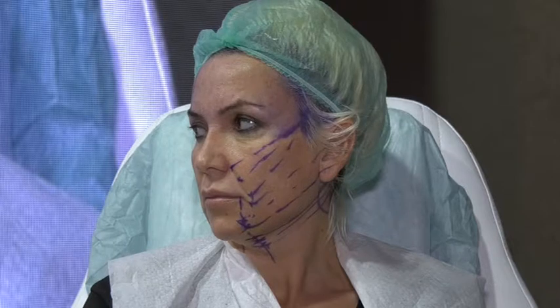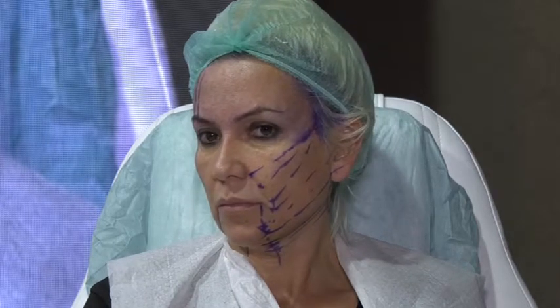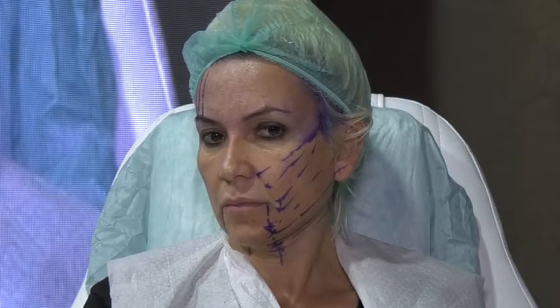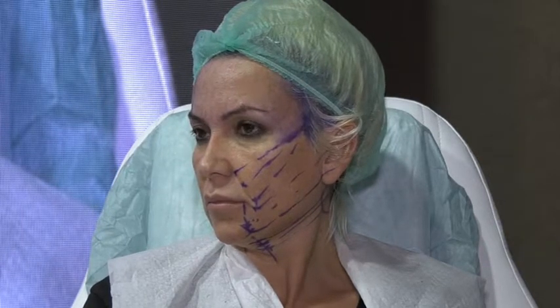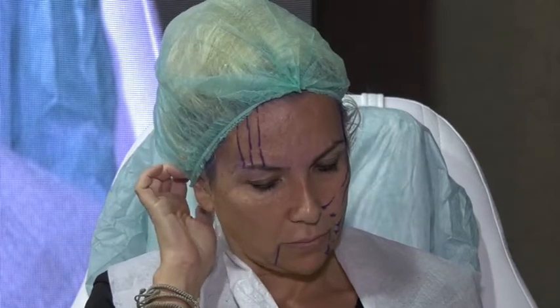So this nose is mainly for Arabs, Europeans, Caucasians, Turkish people, for people who have a nose that is a little bit longer, inverted down a little bit, with a broad dorsum of the nose. I can make it tapered, I can make it slim, I can make the nose a little lifted, I can create a very good shape of the nose, but this is not for Filipino girls, it's not for the Asian nose, please. Please don't mix this technique up.